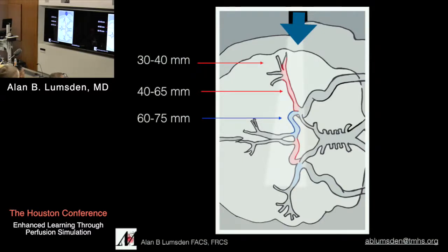We're going to come to that. So when you're trying to get it down from 4% to 2%, it's very hard. You have to have some way of trying to figure out when it actually happened, because you can't fix everything after the fact. And so the advantage of TCD is it shows you in real time when stuff hits. It can't really distinguish the gas from the particulate when it is hitting here. And we record these things synchronously, so even after the fact, we can go back and look at when the surgeon did this and all the stuff hit there.